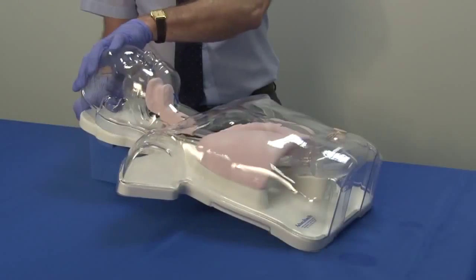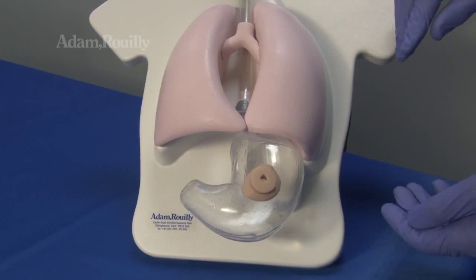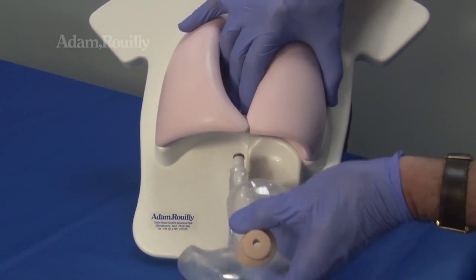After use, to clean or replace the stomach, remove the outer transparent cover. Press the grey quick-release button on the connector and pull the stomach downwards to remove.